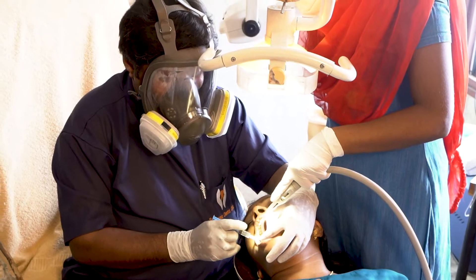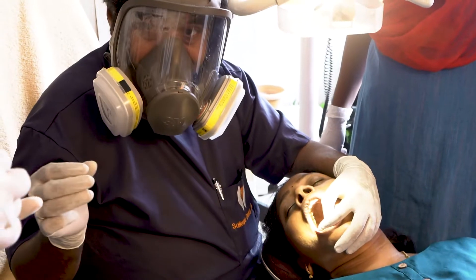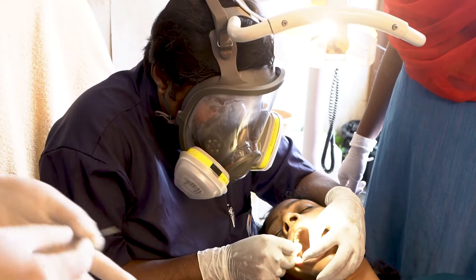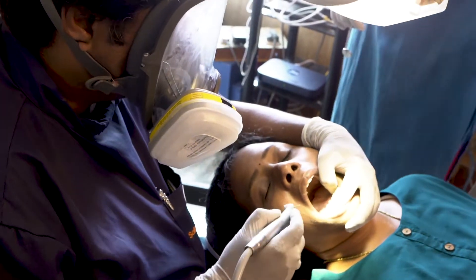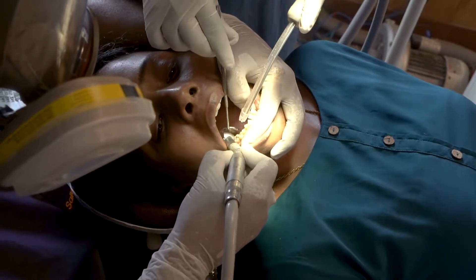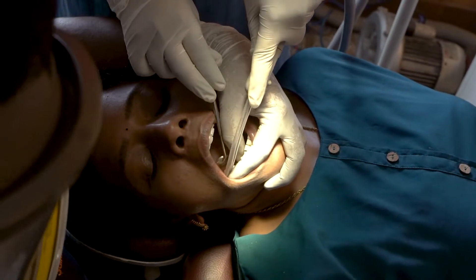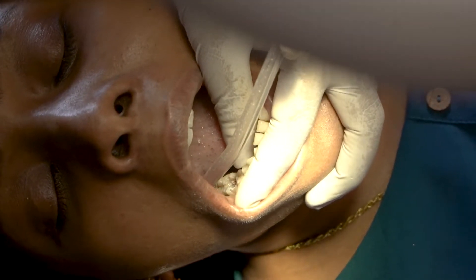Then obturation is being done. The respective gutta-percha points are being placed inside the canal. This is the composite from Mather's Dental called Sparsley Universe — they are bulk fill composites which can be used for core building as well. The remaining caries is being removed.